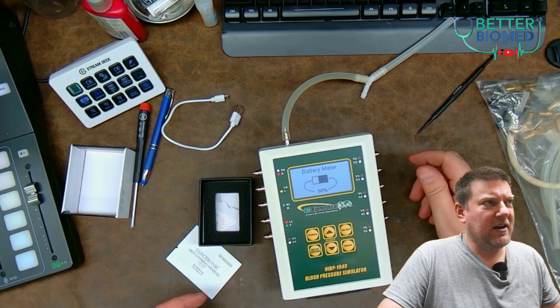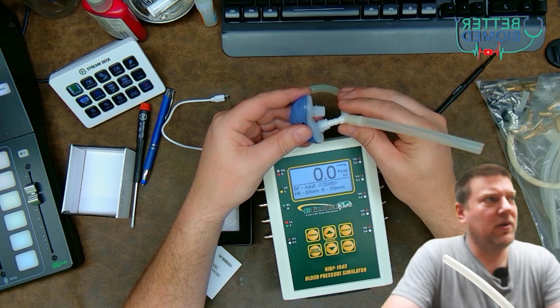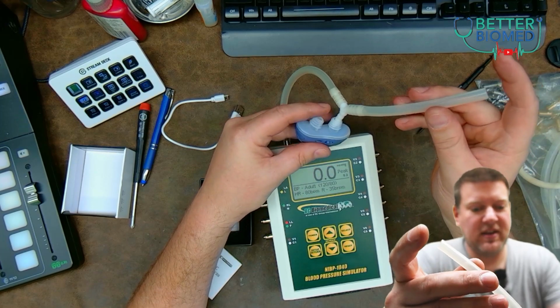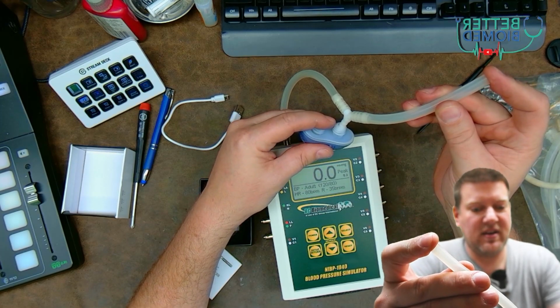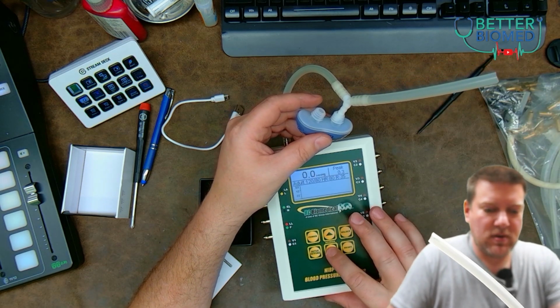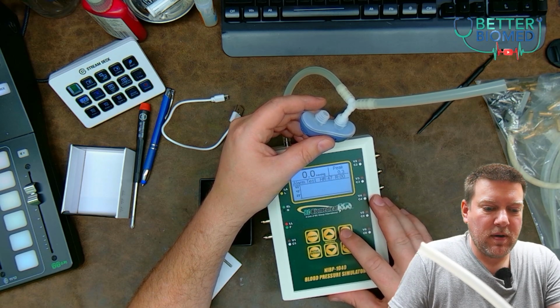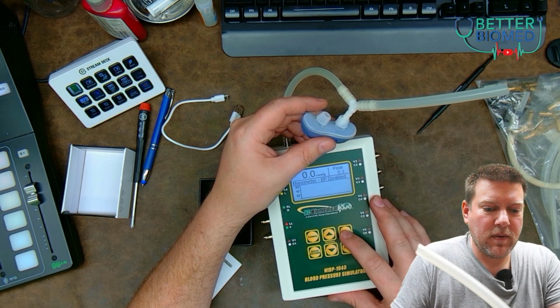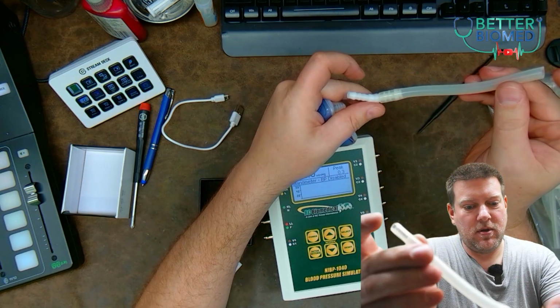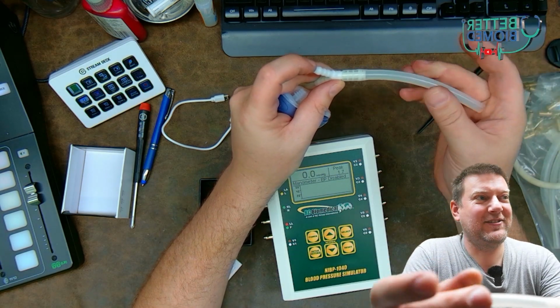Okay, there you can see my display. And again, this is a tight fit because this is silicone. And no matter what, you should see, watch, I'll push down on this and you will see it register. Ready? Tell you what, let's go to manometer mode. There we go. And with this, ooh, that's sensitive. That is so sensitive.